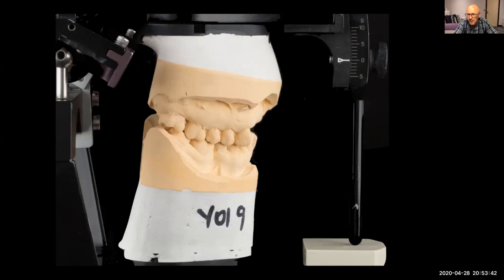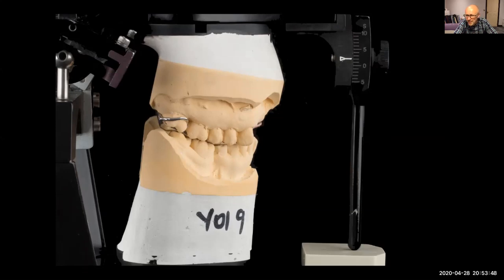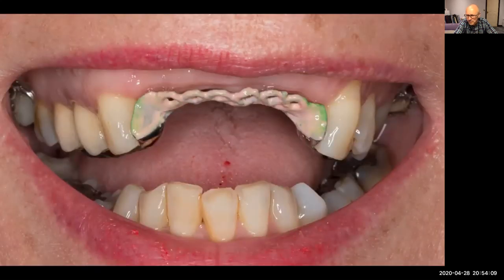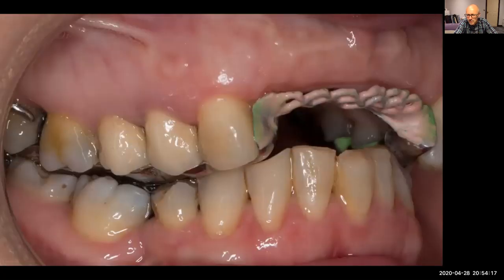Just look at when I actually put the metal framework on, it opens the bite 2 millimeters there, and we've got a lovely even occlusion on that. I try this back into the mouth. Once we've had the chrome made, we check it, making sure it fits perfectly, using occlude spray. Superb. In the mouth, making sure it fits. And this fitted perfectly. I did not need to adjust it. And then even better, when she occluded, it was beautifully balanced.